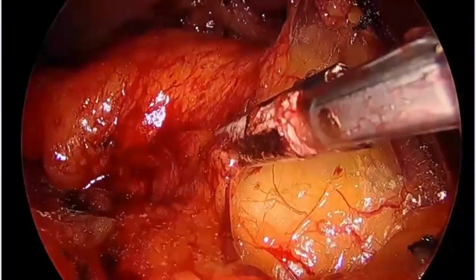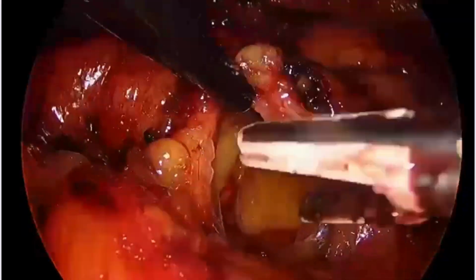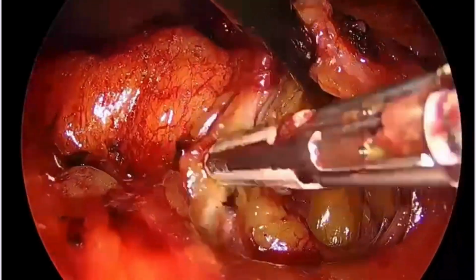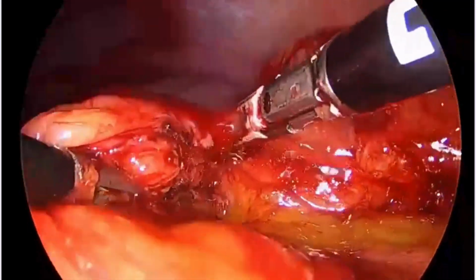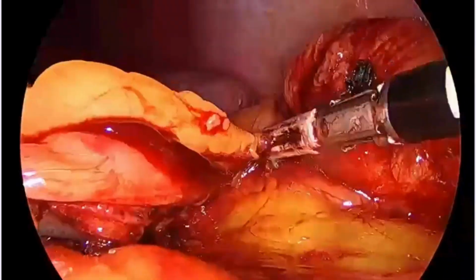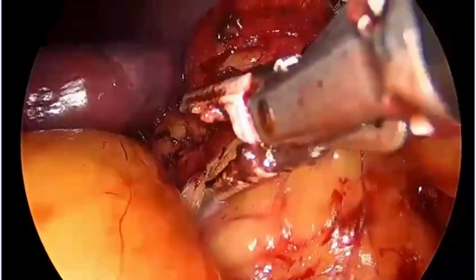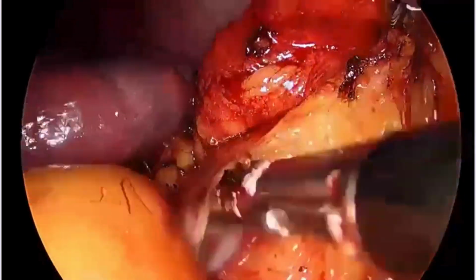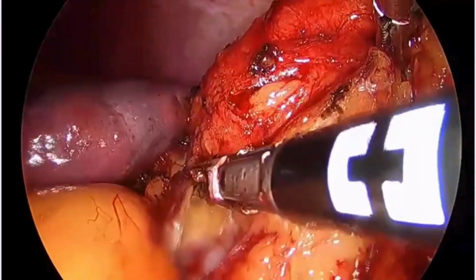We had to actually dissect more cranially than the usual dissection, and only after a while we could identify some kidney anatomy because it is all adhered all around. So we used ligature and gentle dissection was started, because wherever we were trying to dissect, the patient was bleeding, and we had to do it with utmost care and gentleness. And after a while, for the very first time, we could identify the renal vein, and only then we started going more confidently towards the other part of the surgery.